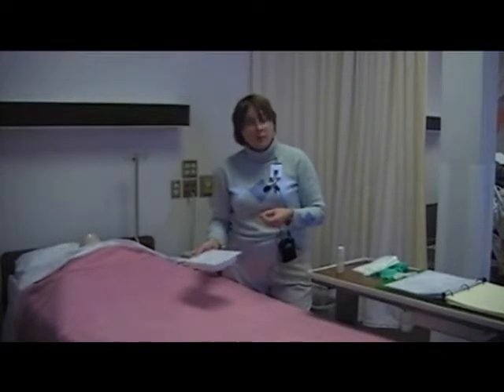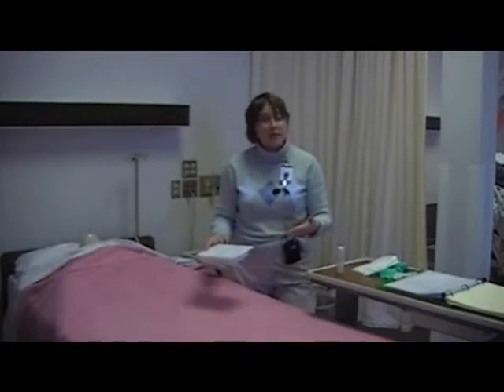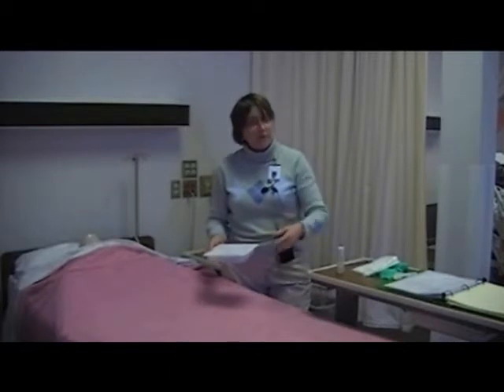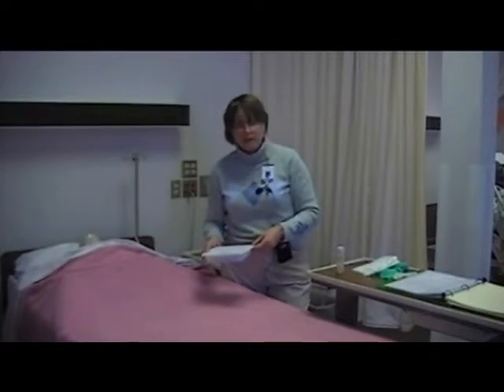Your policies will tell you if they're using the ChloraPrep, or chlorhexidine is the correct term, or if they're still using alcohol and betadine. So you've got to always check your policy before you proceed with a procedure. Don't just assume that you know how to do it because you were shown in school. The hospital may be a little different.